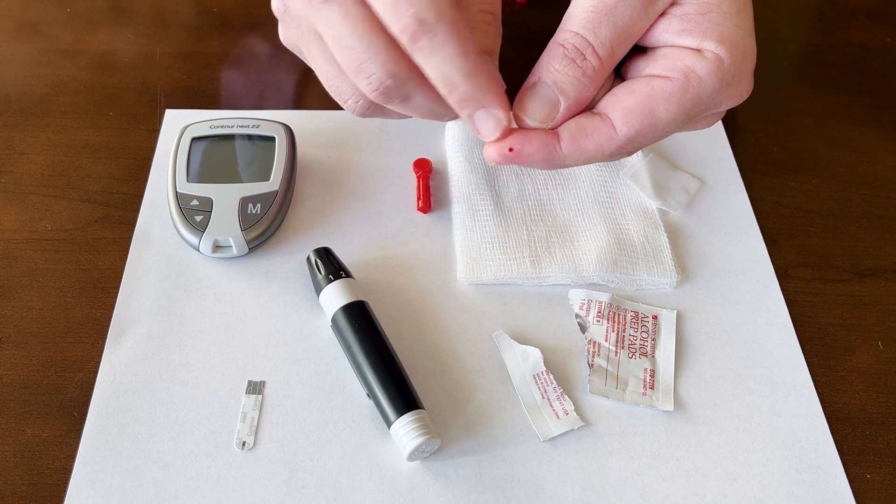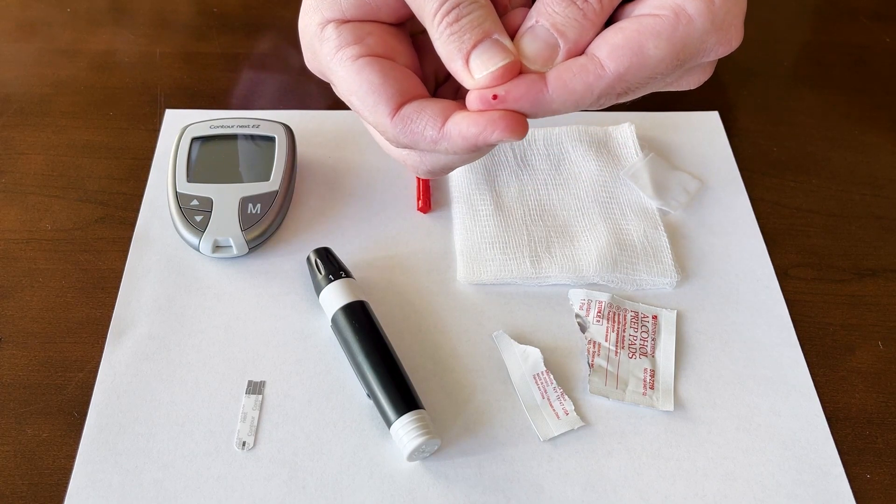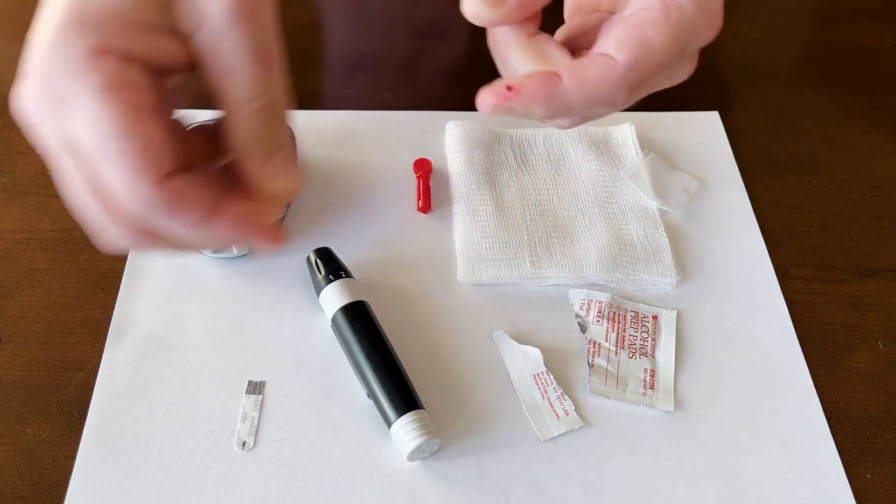You're going to get a little bit of blood. Sometimes you do have to milk it just a little bit, just like that.